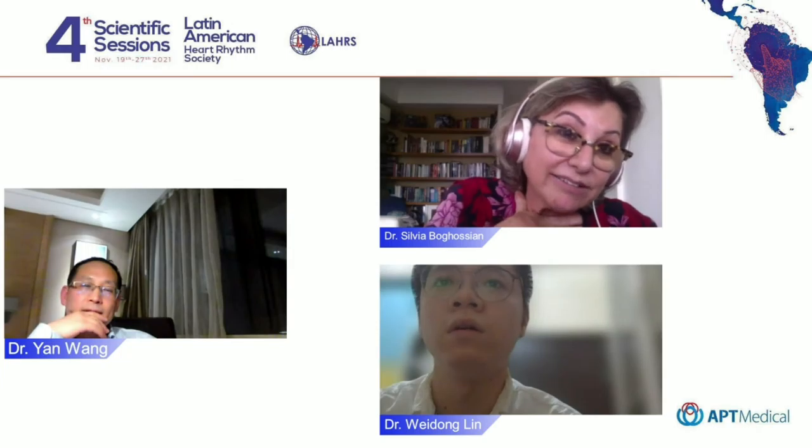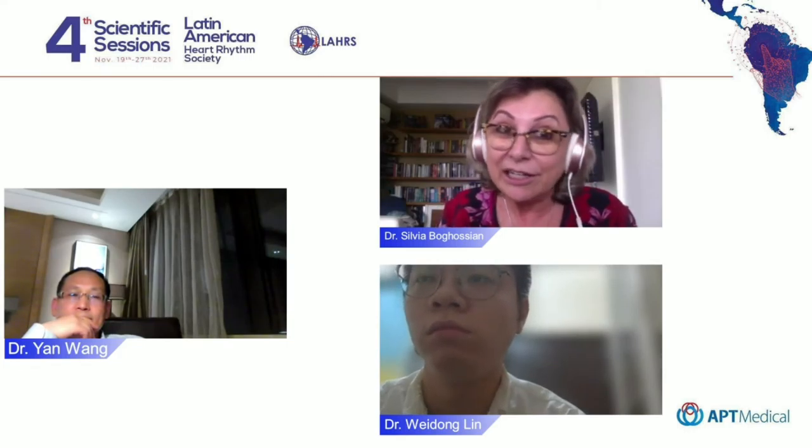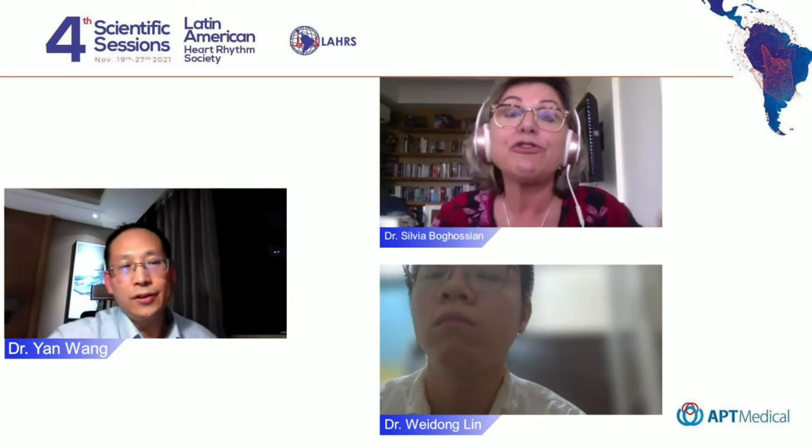I thought it was interesting because she had a previous ablation. They did not have the CS catheter in place. They ablated the right side, and then when it came to me, it was left-sided. So I thought it would be interesting to show that sometimes you map without the CS and you just go to the wrong side. You need the CS at the beginning of cases. It came as a right-sided atrial tachycardia, and it was not right-sided; we could see it with the CS catheter before we mapped it. It was faster when we have the CS, even with 3D mapping.